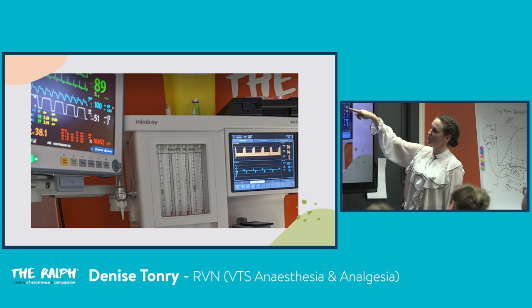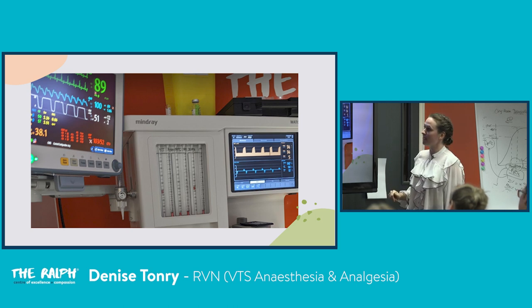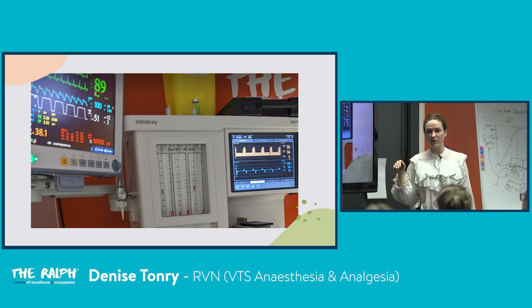This is our PIP here of 14, so that number I was talking about. And this is the tidal volume, approximately, I don't know, 147. Even when we're ventilating them, sometimes it's 50. And again, if the patient's blood pressure and heart rate are stable, we don't necessarily drive up ventilation just to achieve 35 to 45.